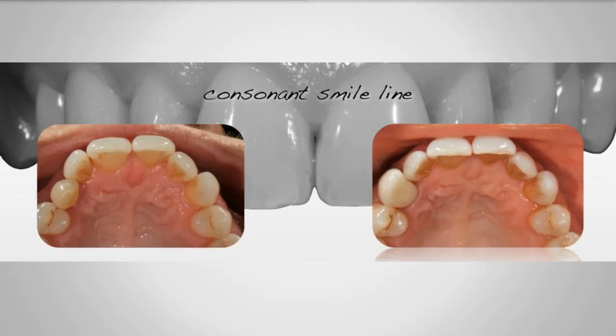The reason is, I've just learned over the years, these things will indiscriminately pop out if you don't mechanically lock them in. The patient could be embarrassed or something and think that the world is falling apart. Even though it's not a big deal, it concerns them. So by placing a little mechanical undercut, you're assured that it won't come out until you want to drill it out, if you want to remove it.